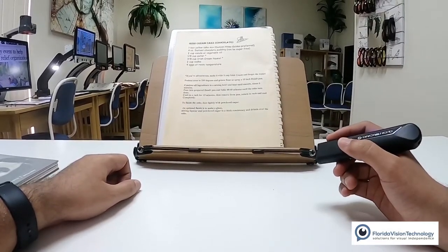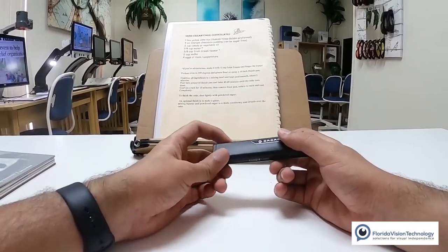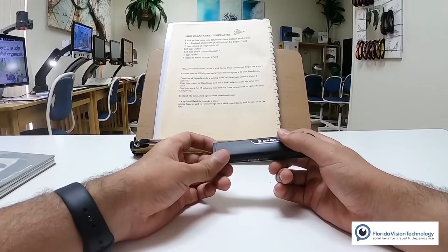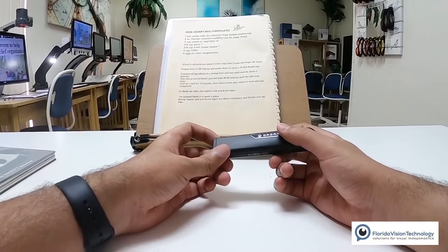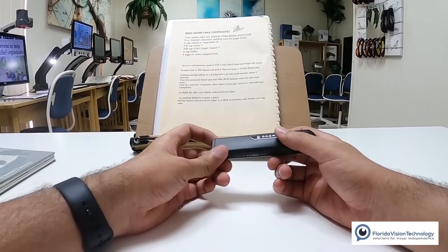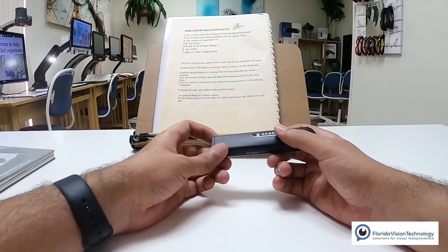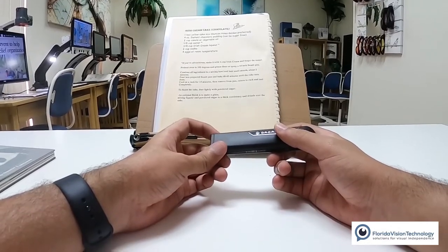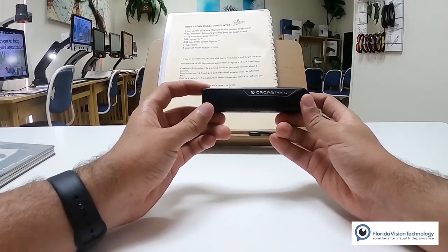With the new features of the OrCam Read, they've actually added voice commands. If I double-press that trigger button, I can say things like 'battery status' — battery is 58% charged, not charging. Let's double-press again: 'tell time' — the time is 10:54 a.m. Let's try it again: 'tell date' — today is Wednesday, September 2nd, 2020.